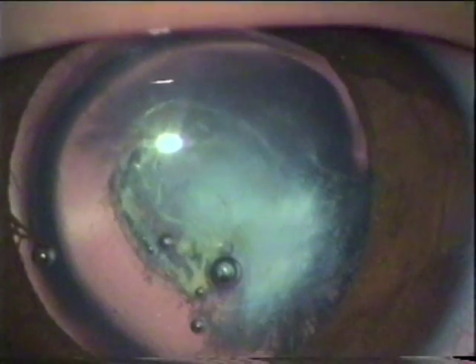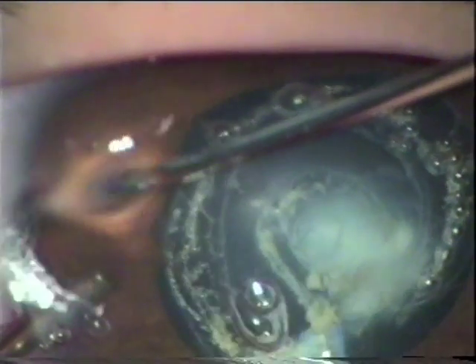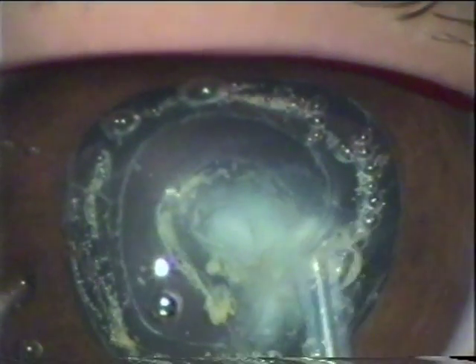Making a small capsulotomy in the center. Then going around the first capsulotomy and making a large capsulotomy.